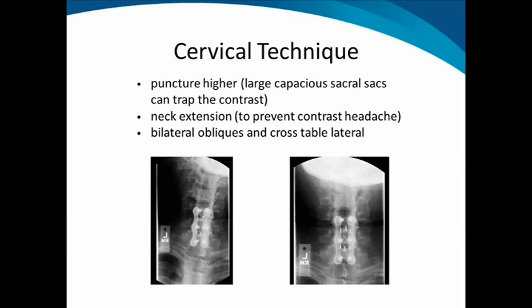Not all myelograms are lumbar myelograms. A cervical technique can be performed with just as much ease. We no longer do cervical punctures for this indication. Almost everyone can undergo a standard lumbar puncture, perhaps 1 or 2 levels higher than typically performed for the lumbar spine. And with the gravity tilt table, the dye flows very easily to the cervical spine, and we can perform very nice cervical myelography with a slightly modified technique as shown here.